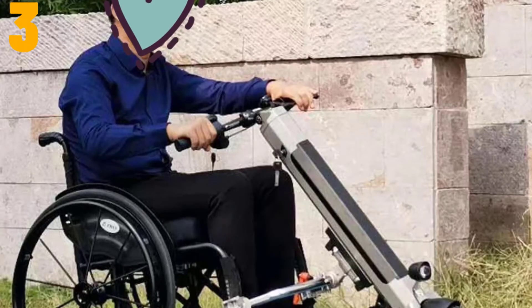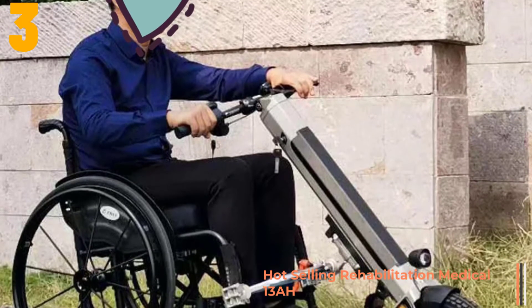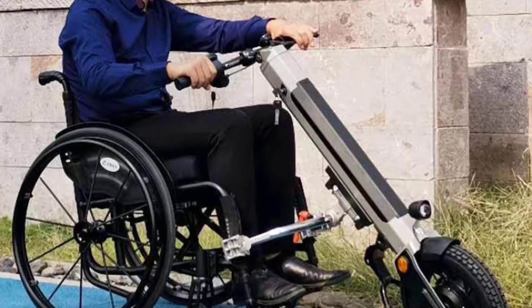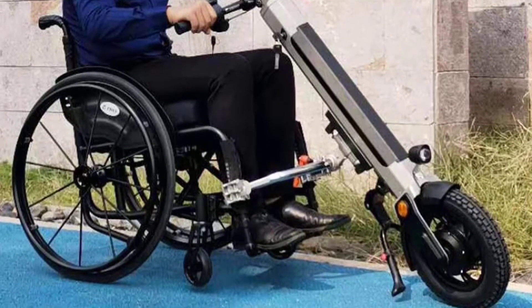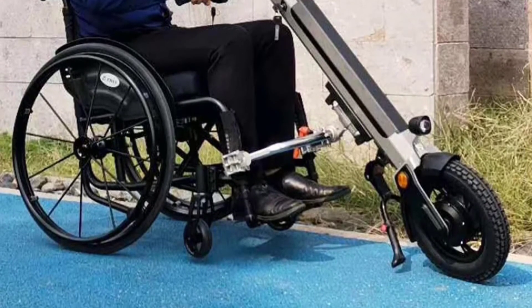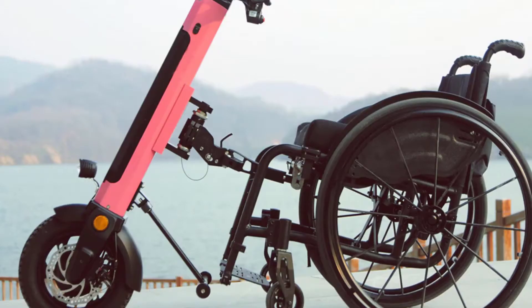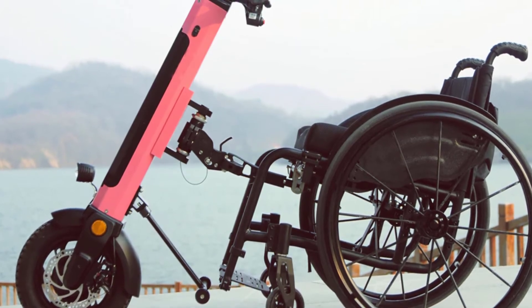Item number 3 is the Rehabilitation Medical 13A 350W Electric Wheelchair. Specifications: Frame material: 6061 aluminum alloy frame. Motor: 36 volts, 350 watts brushless hub motor. Controller: intelligent controller. Battery: 36 volts, 13A standard, 20A lithium battery. Charger: AC 100 volts to 240 volts, 2 amp smart charger.